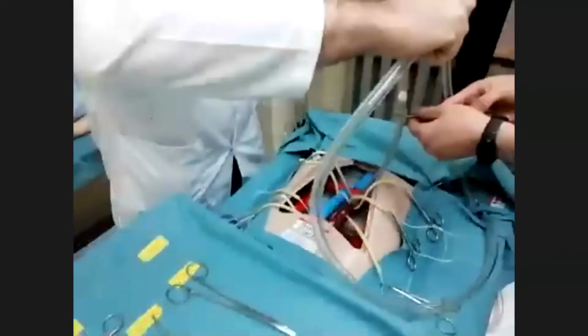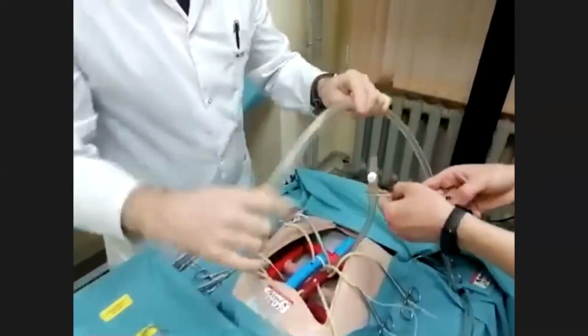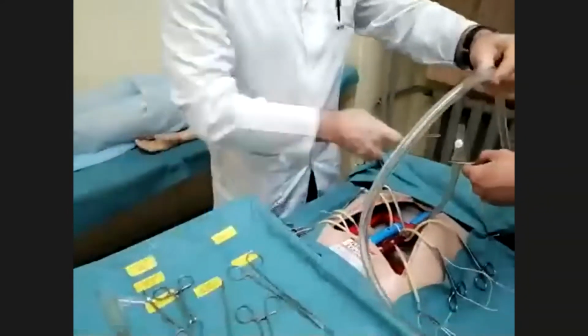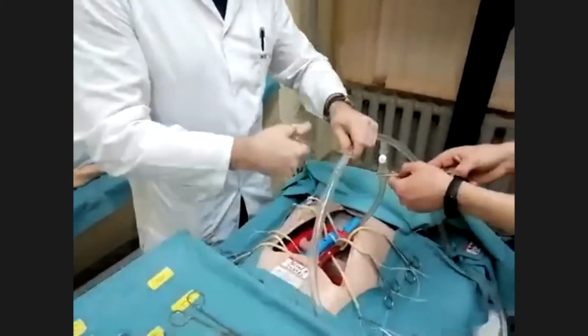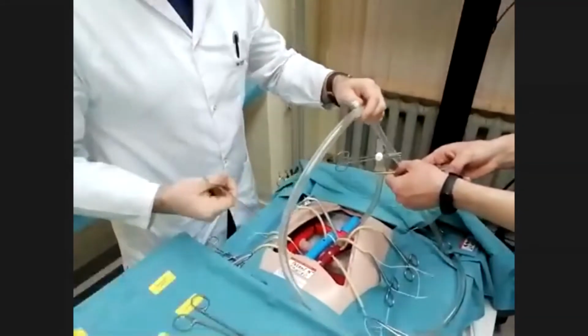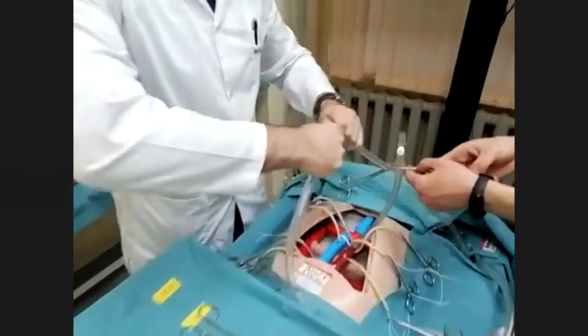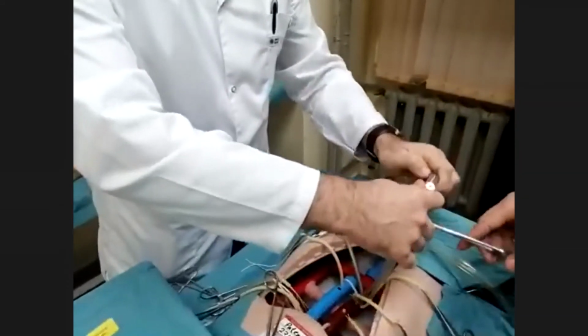Take this tube. It's an arterial line and a venous line. Clamping. Then I connect the arterial line to the arterial cannula.